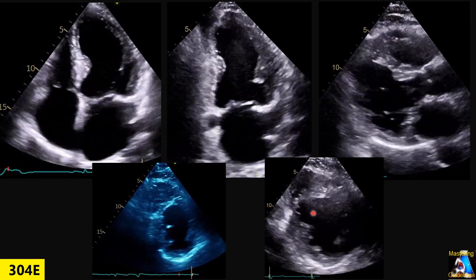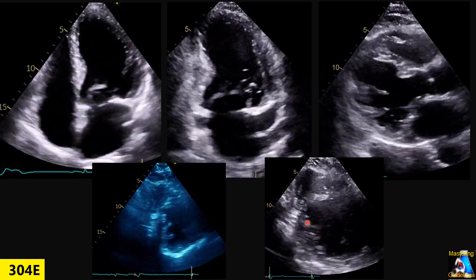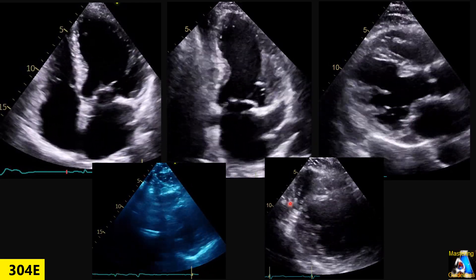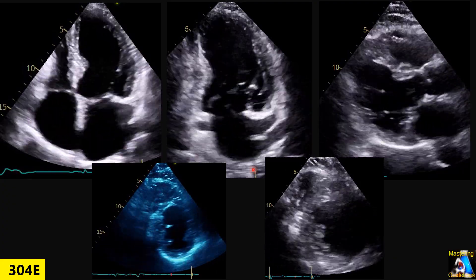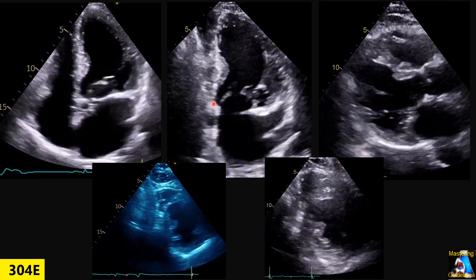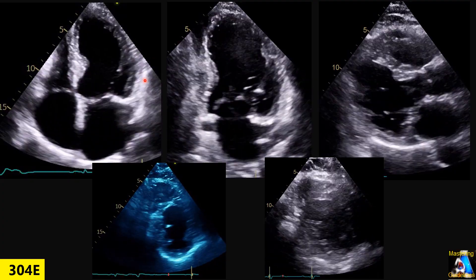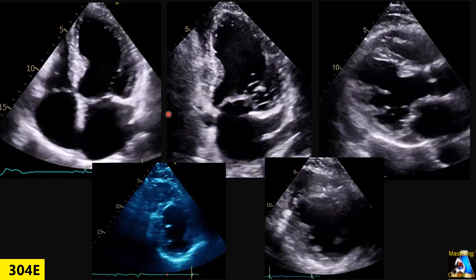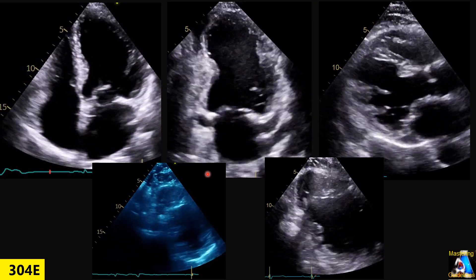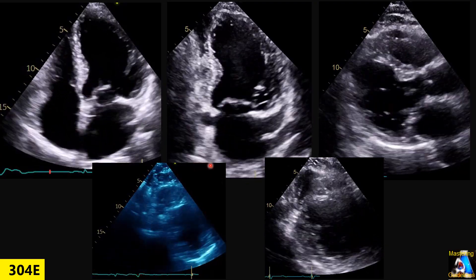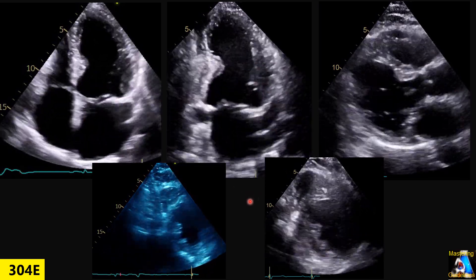At the inferior wall close to the basal view at the level of the inferior septum, we have what appears to be akinetic motion. So all of these findings represent that the patient has CAD. Post-procedure CAD can happen for many reasons, which we are not going to discuss here. One could argue the patient with cardiomyopathy can also have add-on CAD.